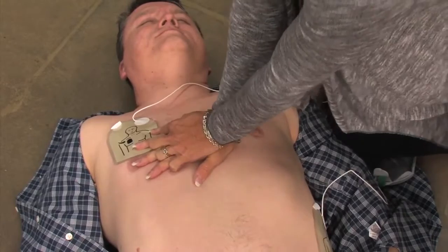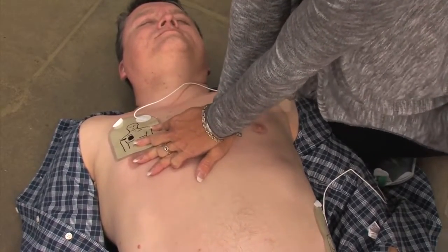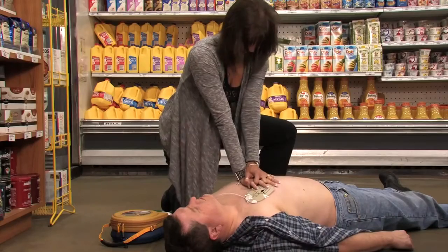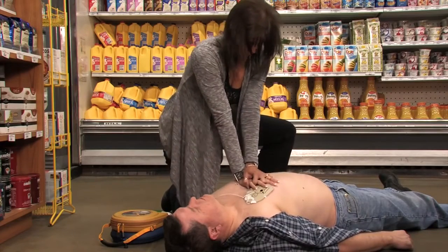Sometimes no shock is needed in a life-saving situation, and the Samaritan PAD will tell you if that is the case. If CPR is needed, it's important to apply effective chest compressions for two minutes.